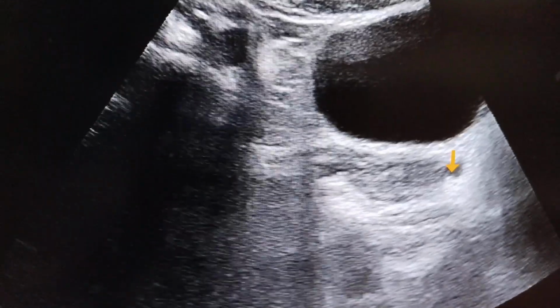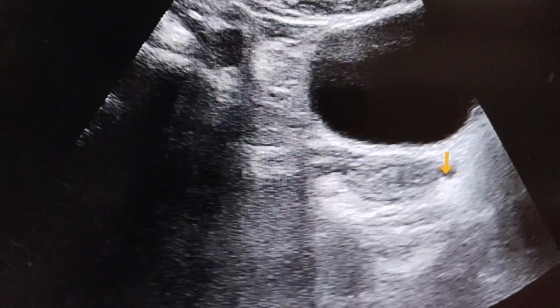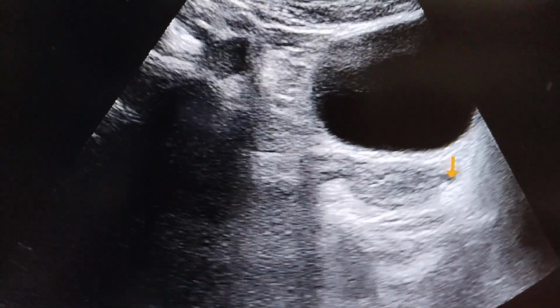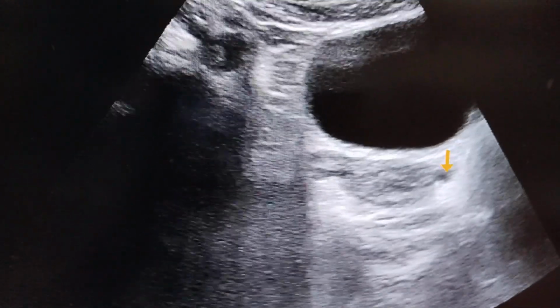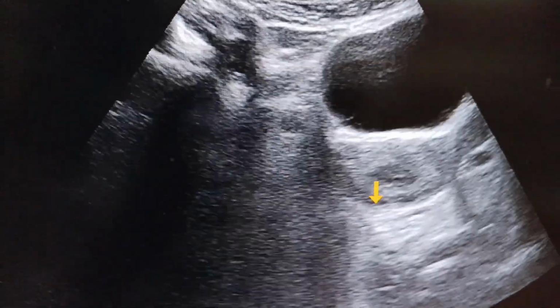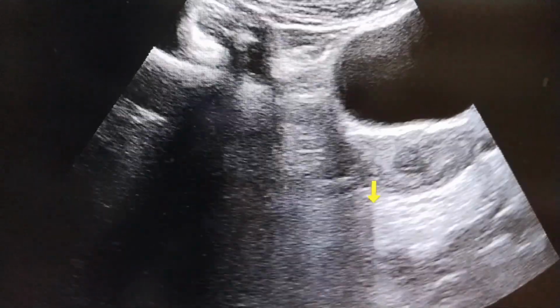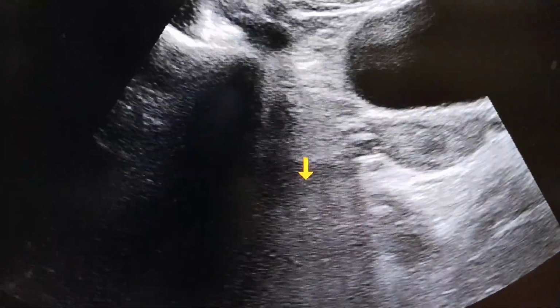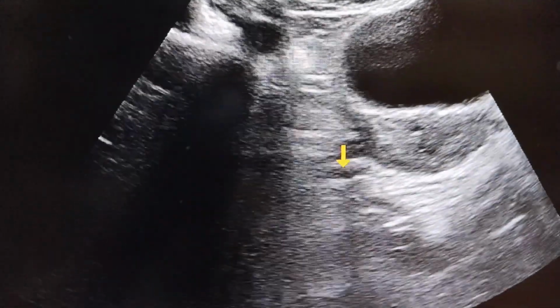Due to which there is a left-sided hydronephrosis and hydroureter. This one here you can appreciate. And now I am going to check the right ureter, distal ureter. This is the distal ureter.